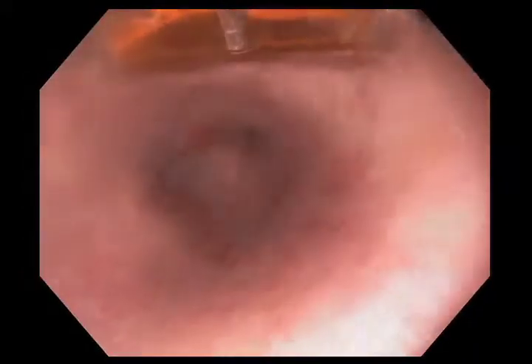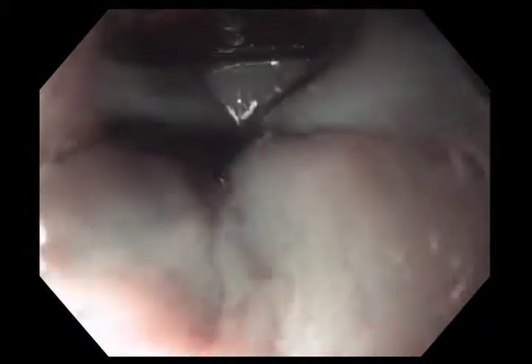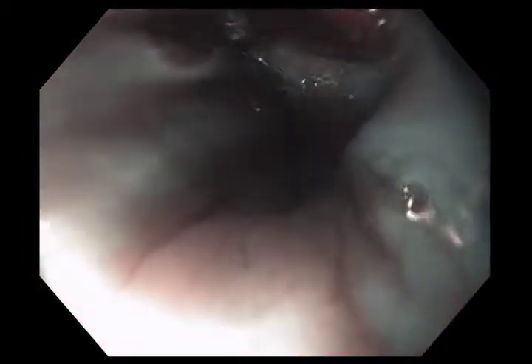We're now nicely in the esophagus using white light, but now we've switched to NBI again because it shows us the Barrett's epithelium better. There's that island at 9 o'clock that we saw before. We torque the scope so that the island is at 12 o'clock, apply up-down deflection, and then simply push the pedal to deliver the energy.